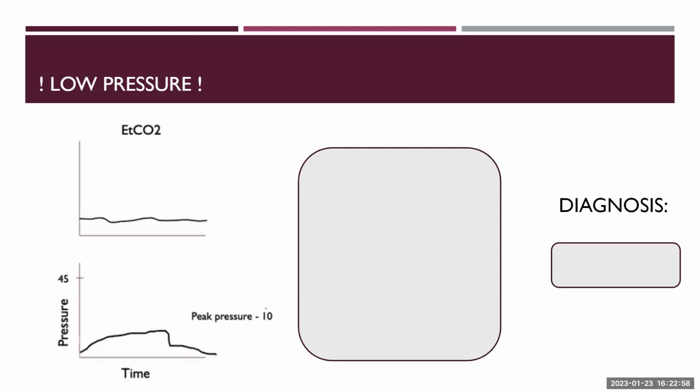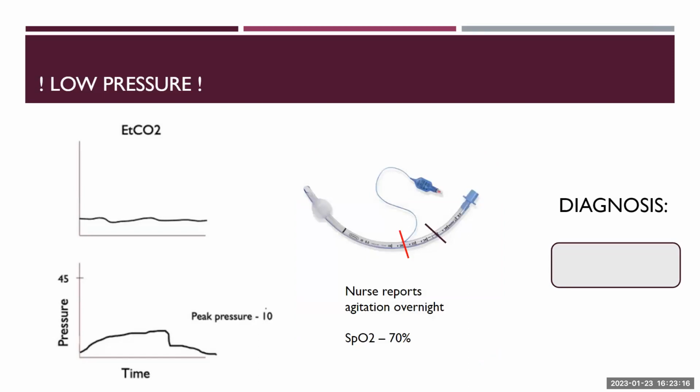Does anyone remember where that leads us in terms of our differentials? Jessica? I'm just thinking there's something wrong with the vent or the tube or something. I don't know what exactly. Perfect. So yeah, there's something wrong with the vent.